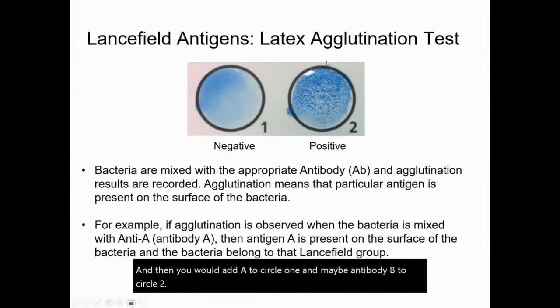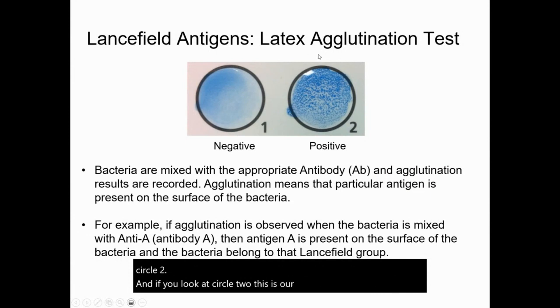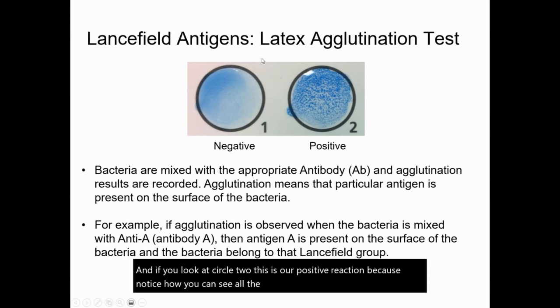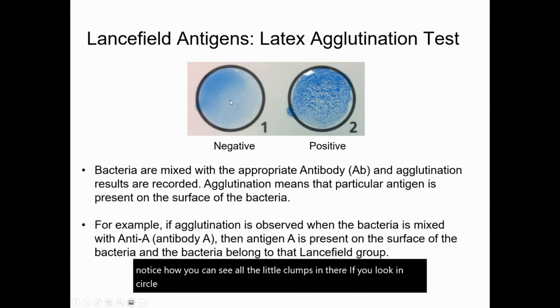If you look at circle two, this is our positive reaction — notice how you can see all the little clumps in there. If you look in circle one, it looks pretty smooth and pretty even compared to circle two.